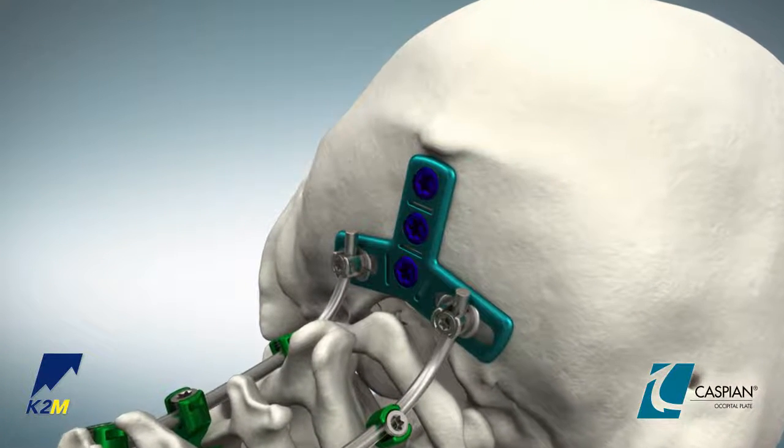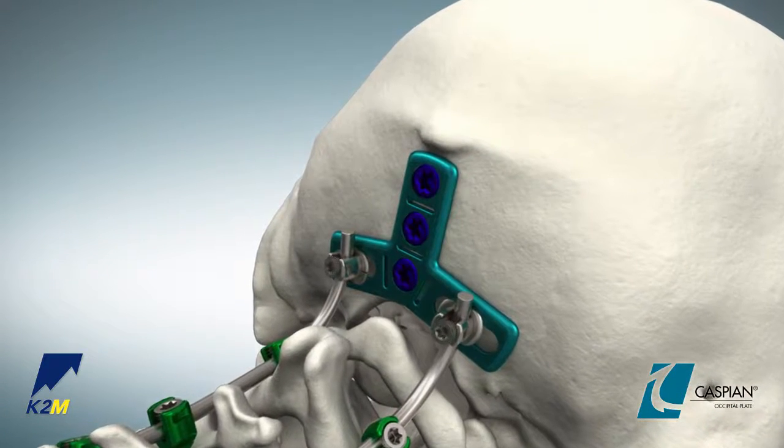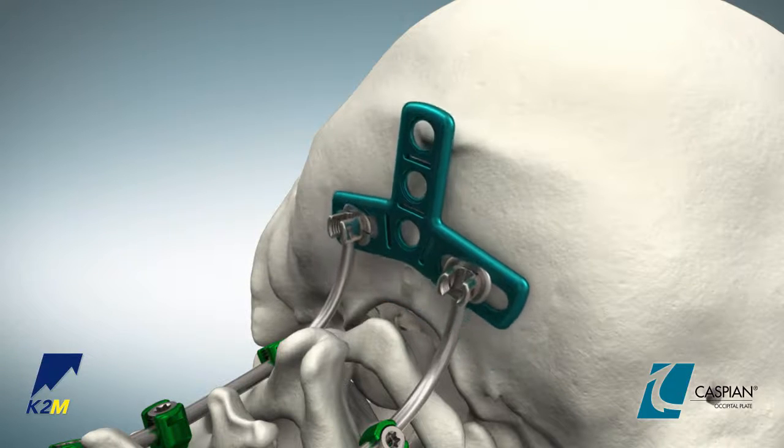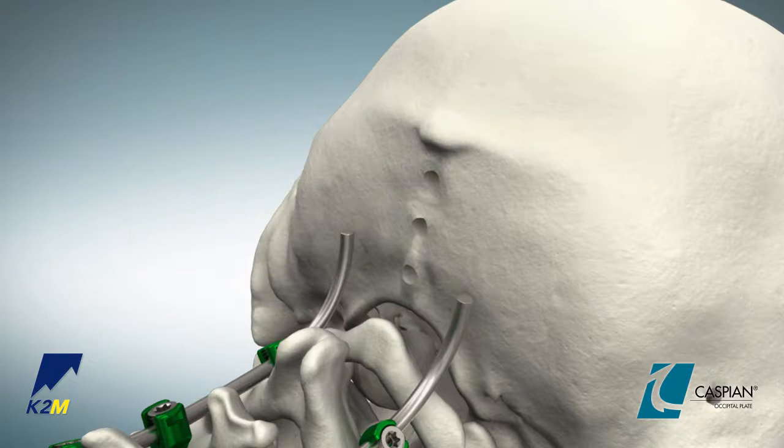If removal of the occipital plate is necessary, engage the size 15 and size 20 non-tapered screwdrivers in the mini set screws and midline screws respectively and turn counterclockwise to disengage the plate from the rods and occiput.